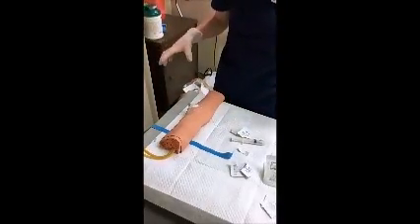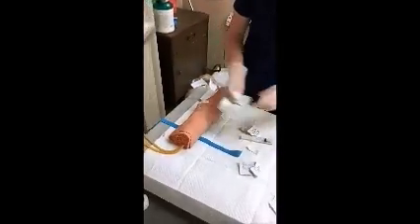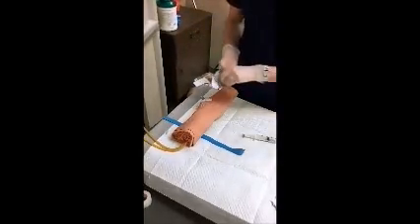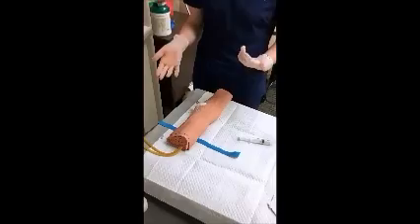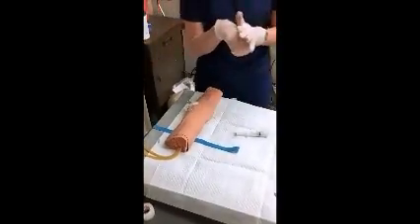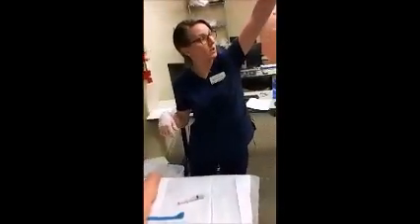Get rid of all of our excess trash. Your patient's pretty stable right now. They're hanging out, you're chatting with them, making sure that they're not getting dizzy or anything from having an IV placed. Then we're going to go over here.